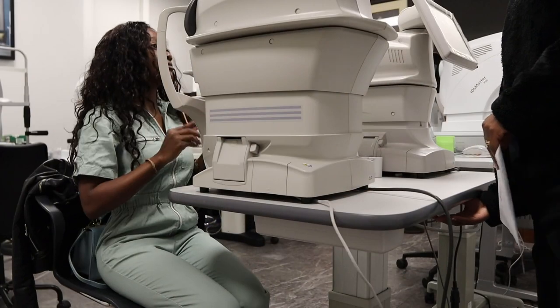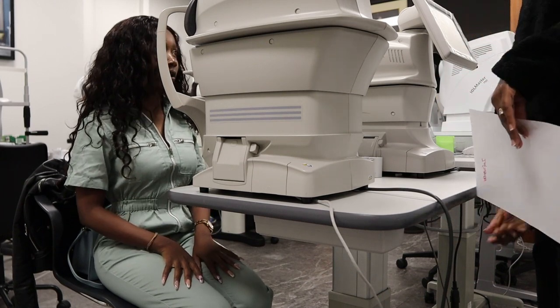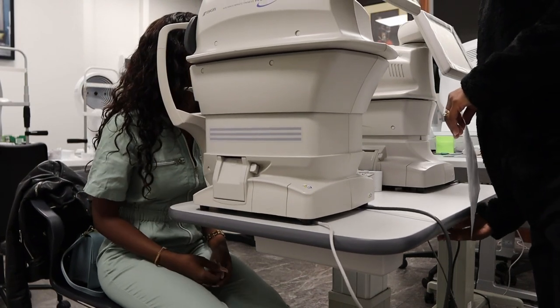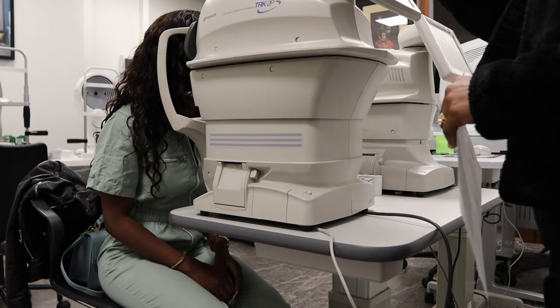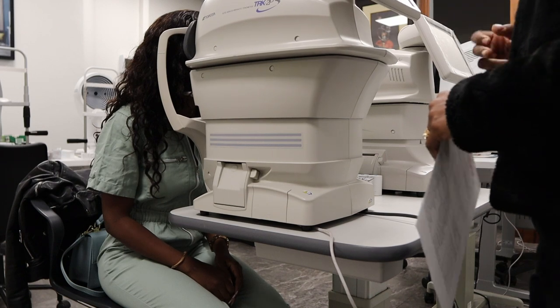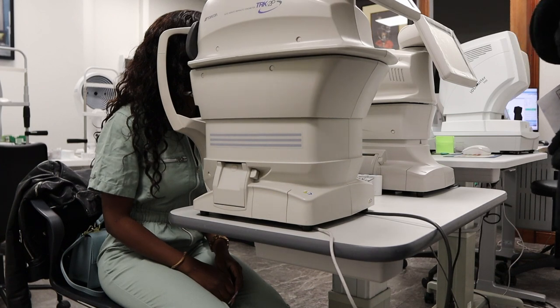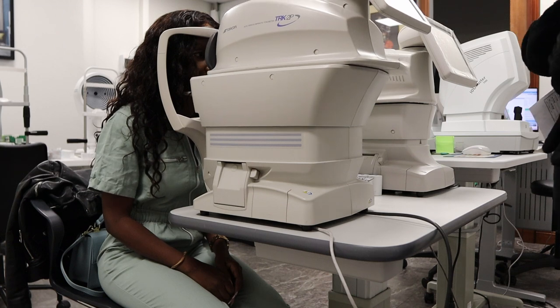I'm also going to get your eye pressure. Sure. For the eye pressure, it's going to blow a puff of air three times. It's going to be a little bit uncomfortable. Okay. Yeah, just be ready for that. Sure. You can please come forward, place your chin on the chin rest, and make sure your forehead is touching the top. Yes, that's perfect. Just keep looking at the image inside the machine.